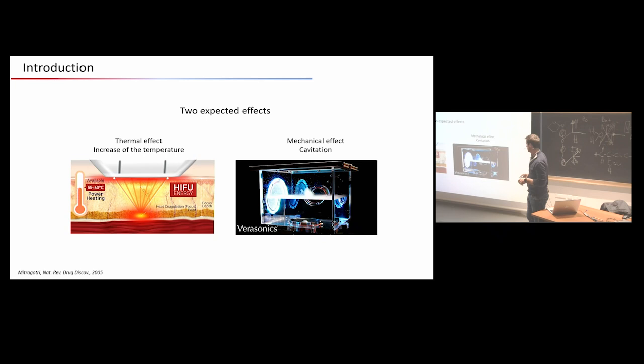Oops, sorry. So when we are talking about therapeutic ultrasound, there are two effects. The first one is the thermal effect. You are propagating an ultrasound wave into a medium. This wave is going to be absorbed by the medium, so it's really depending on the property of your medium. You know that most of you are physicists, right, or have some good basics in physics. When you transmit an energy into medium, this one will be absorbed and you will have a temperature increase. That's exactly what's going to happen when you are going to do a thermal ablation. I'm going to talk about that after.